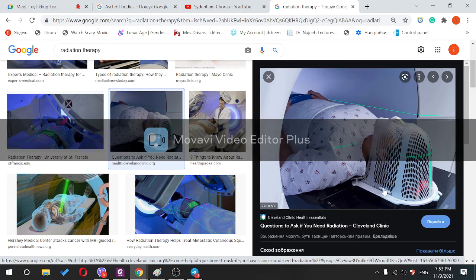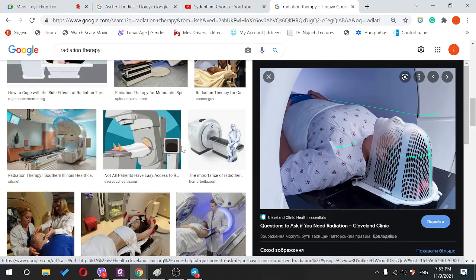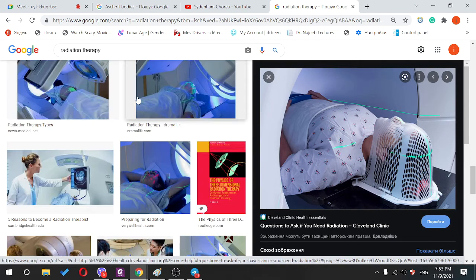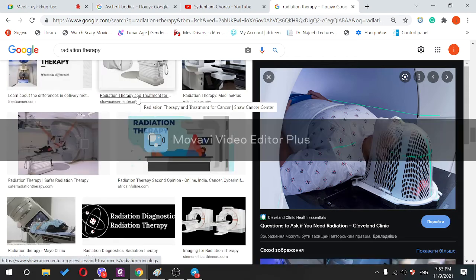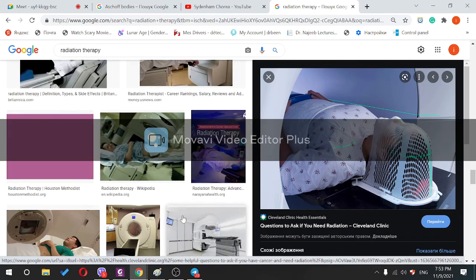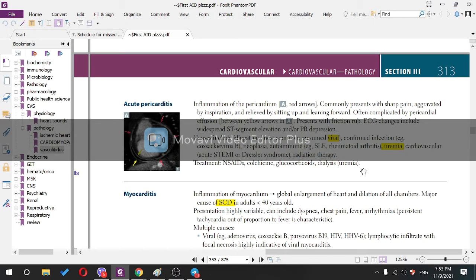See, this thing is fixated. The patient cannot move his head at all. And yeah, it basically tries to reduce the proliferation of the cells. It kills them. Gamma knife, all of this stuff is super interesting. And yeah, one day hopefully I will see one of you working in this field. So, okay, so treatment.